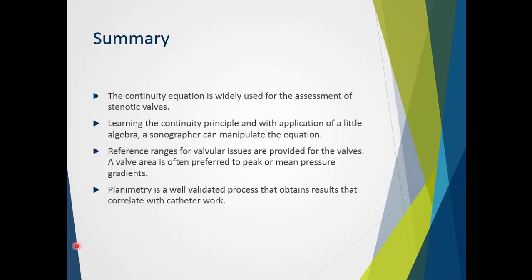So in summary, the continuity equation is widely used for the assessment of stenotic valves due to its high reproducibility in both intra and inter-operator results. Learning the equation and with the application of a little algebra, a sonographer can manipulate the equation appropriately.